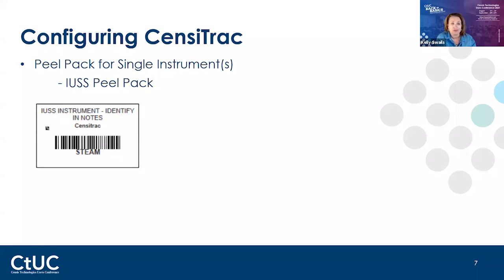But here you see I put in there too, identifying notes. I recommend educating people. Don't just put retractor. Don't just put clamp. Tell me what it is. I need to know what it is, so then I know, do I need to buy more? Do we need some backup? And taking it one step further, if they can put in there the manufacturer and the item number, even better, because then if I'm seeing this, I know I need to order this and I'm going to get the correct one. So if I'm seeing Aesculap ABC-123, then I know, yep, that's the instrument I need to order, not just guessing that this is the correct vascular clamp or something.